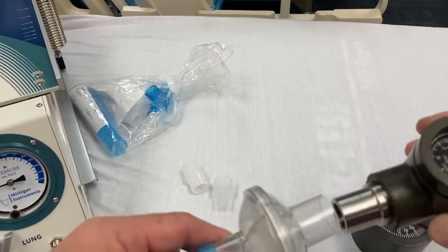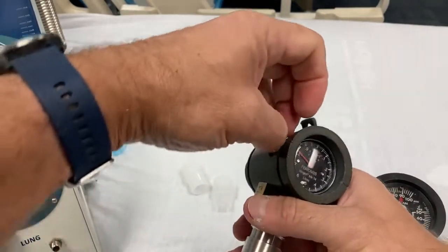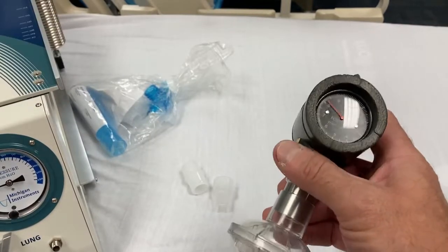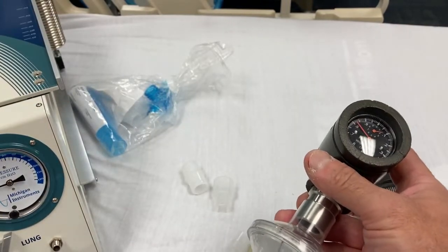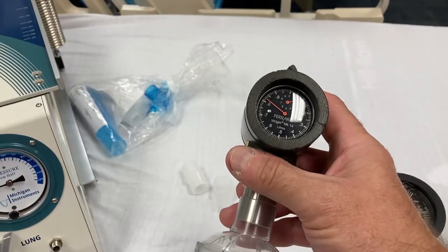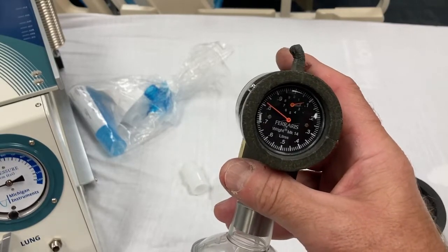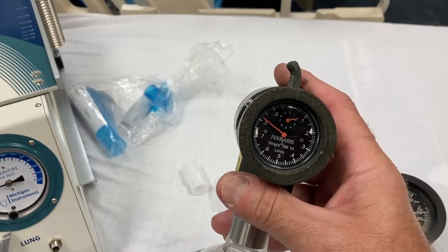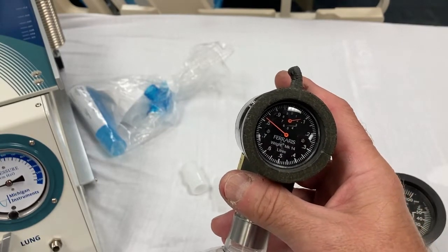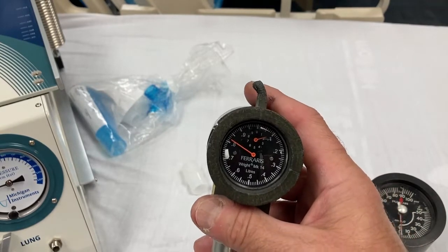And if you remember, that is have them breathe as deeply as they possibly can in and blow that one breath out until you tell them to stop. And again, a lot of times I'll give them a break on the ventilator while I'm calculating the first 3 there. But I tell them, okay, the next one, we're going to take you off the ventilator again, and it'll feel pretty much like it does right now.